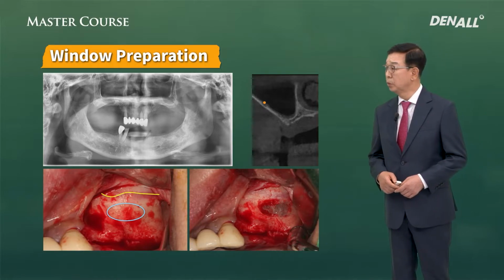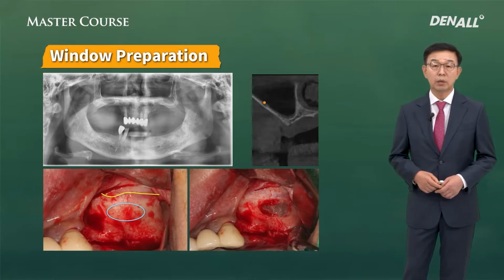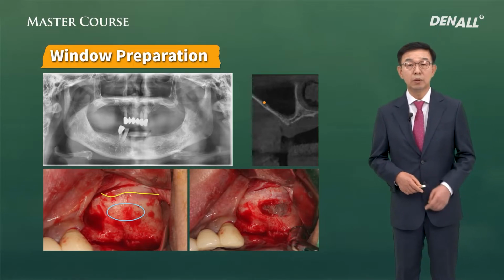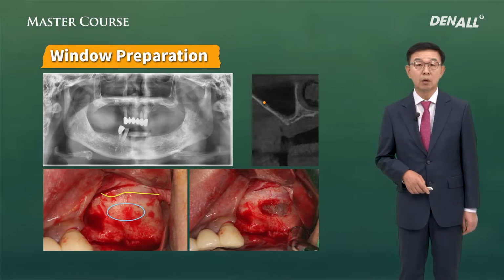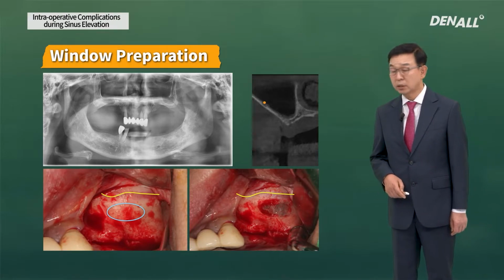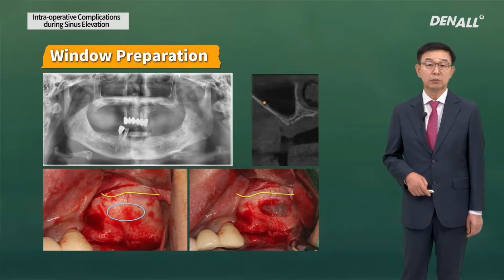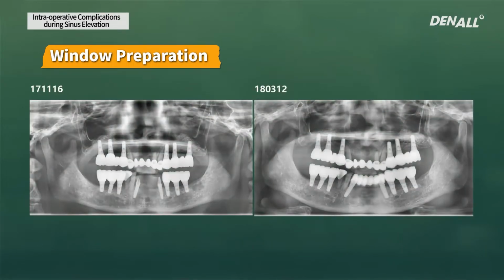Even if it is the same patient, the intraosseous artery position may differ, so you need to be aware. If necessary, you need to take a CT and observe the intraosseous artery ahead to avoid bleeding during surgery. This is after surgery, and this is after implant placement.